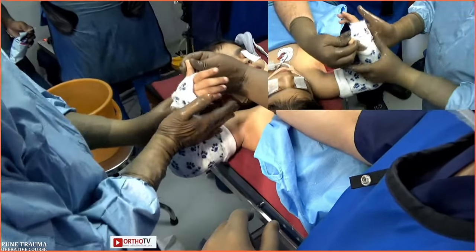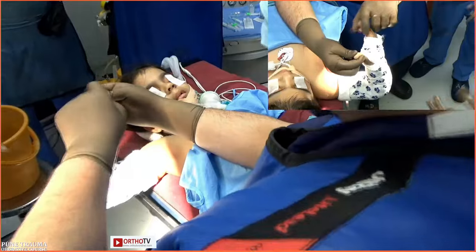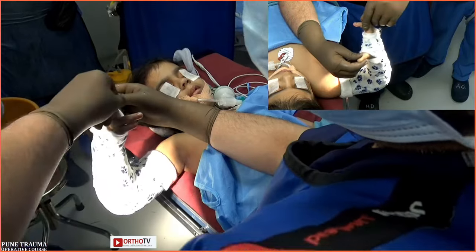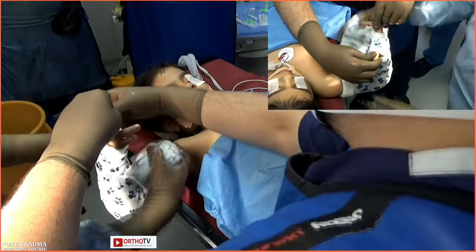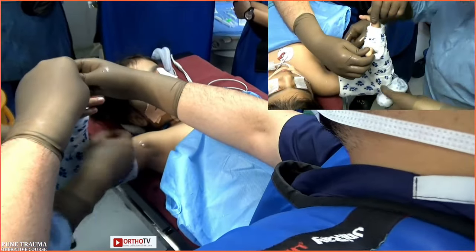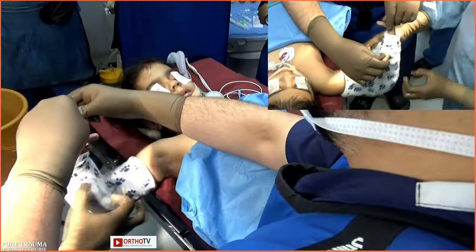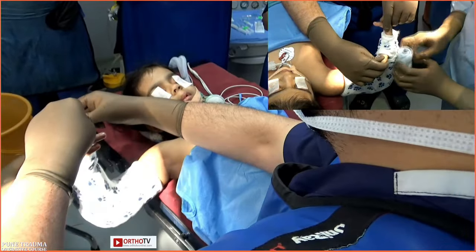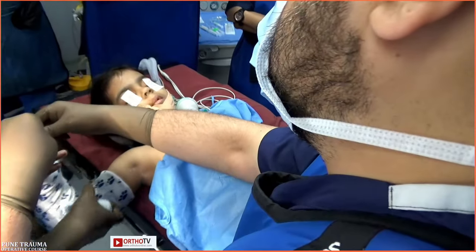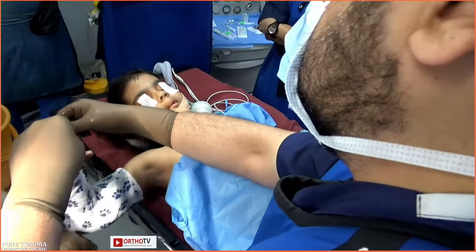I was just coming back to those three points. The first point I said was marking with a skin marking pen. The second point was a wire. Like how you do for slipped capital femoral epiphysis, you keep a wire on the skin and see how it looks on lateral, then keep it on the skin and see how it looks on AP, and with a skin marking pen you draw those two wire lines on the skin, and wherever they meet is your entry point. The third trick I use is a hypodermic needle. I put a hypodermic needle in the direction I want to pass the wire. It's very easy to maneuver. You can also pierce it through the cartilage. Once I confirm my hypodermic needle, I will replace it with a K wire. So these are some of the tricks I use.